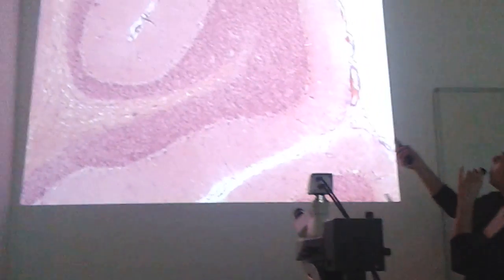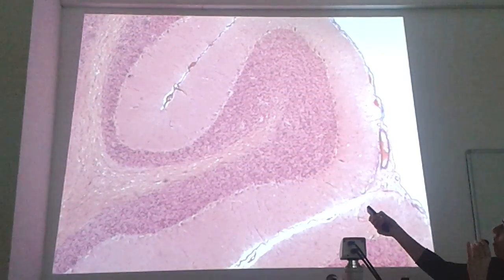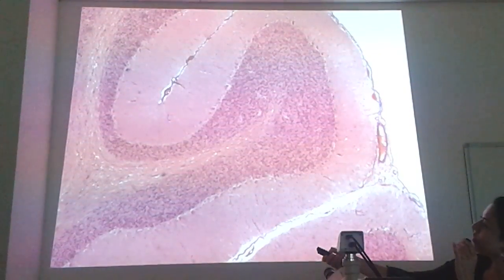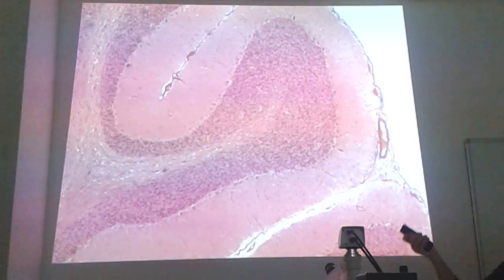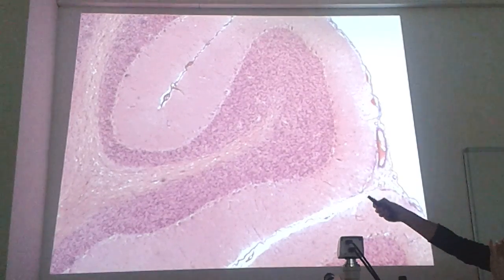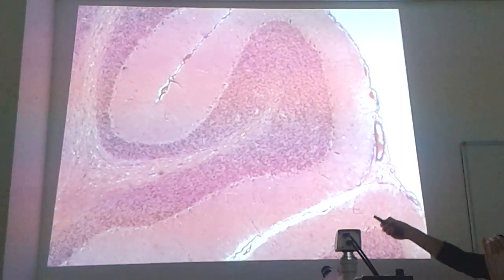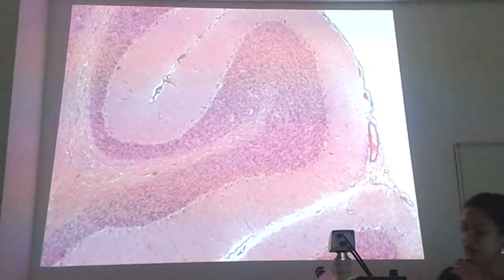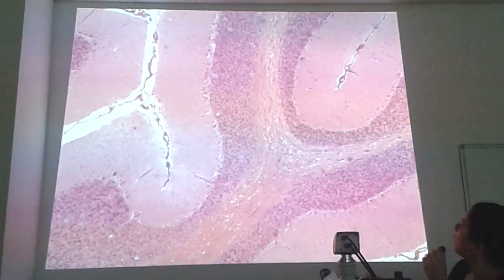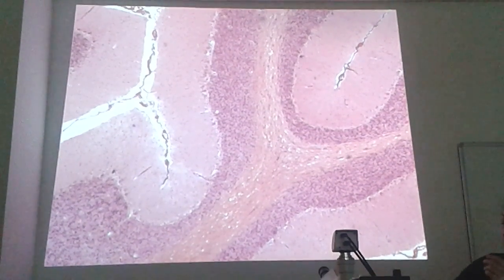Okay, the outside, this part, this is the gray matter, and all which surrounds the folded gray matter is the white matter. So, see, this is all white matter. In cerebellum, because this gray matter is deeply folded, as you can see here, it is like a windy road, okay? So, the white matter just follows this folding. So, as you will see in your slide, see, these are all white matter, where these are all gray matter.